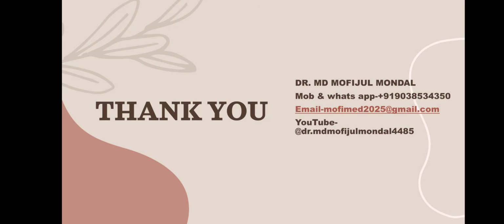With that, we come to the end of today's lecture. I sincerely hope this session has helped you understand not only what should be examined during a TIFFA scan, but also how to examine it systematically and why every image matters. Remember, fetal anomaly scanning is not merely a technical procedure, it is a responsibility. Every scan has the potential to change the course of a pregnancy and profoundly influence parental counseling and clinical management.